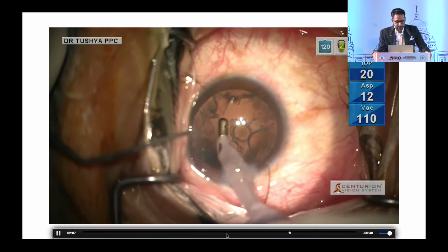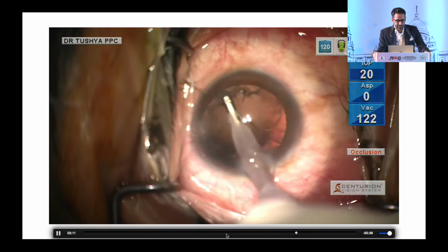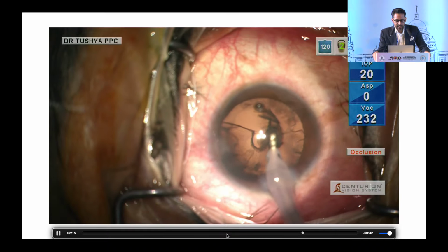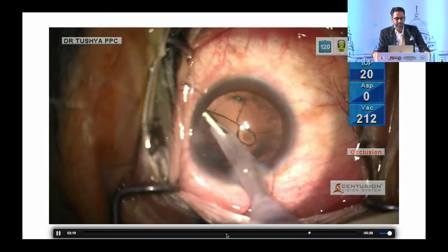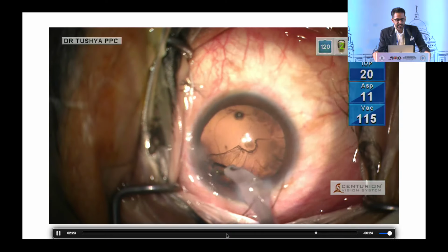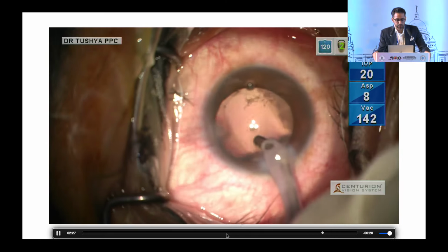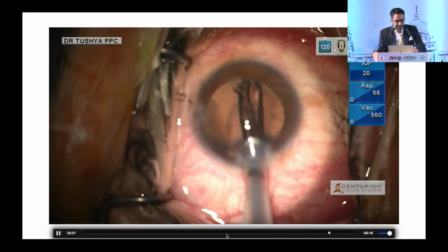So the good thing here was, you can see this PPCD defect which is published by Tetial. He showed that if you get this kind of disc defect, this confirms that it is not a pre-existing PCR. So luckily, it was not a pre-existing PCR, but it had a very high predisposition because there's a plaque right in the center.